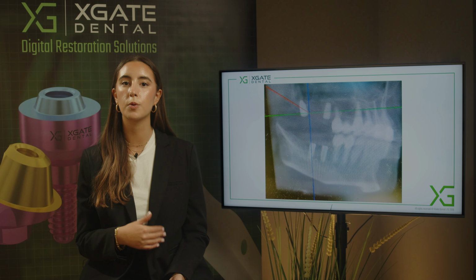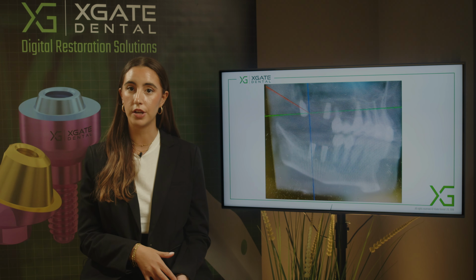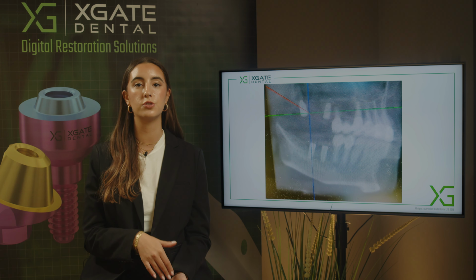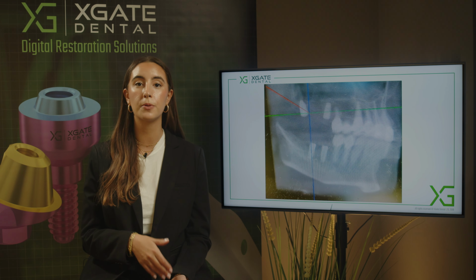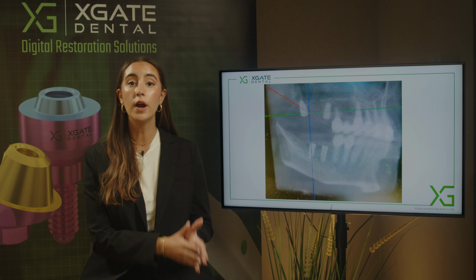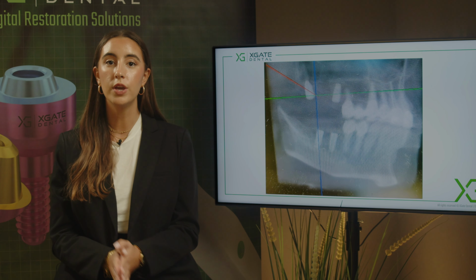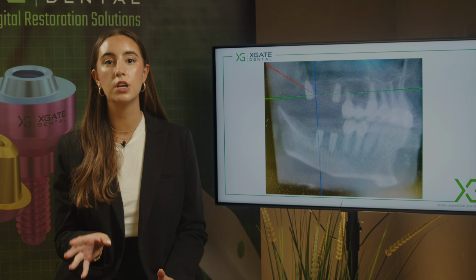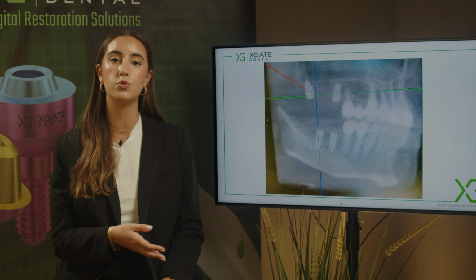What we want to do is place two implants before the procedure. We have the osseointegration, then we cut the bridge in between 13 and 14, and we place an implant. This way, when we have two implants already osseointegrated, we can load the three implants, one of them just inserted into the jaw and two osseointegrated. We can remove a little bit from the occlusion on those teeth, and the patient will have some kind of aesthetical solution for the upcoming 2 to 3 months.